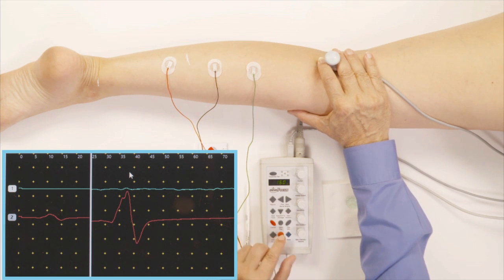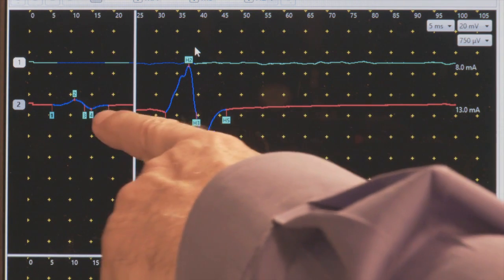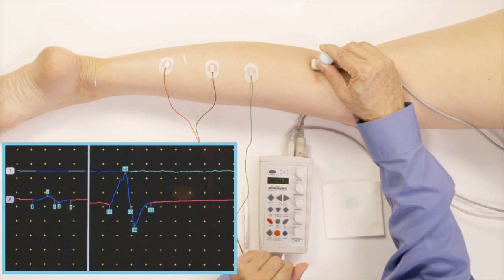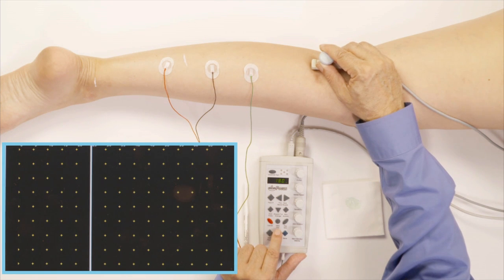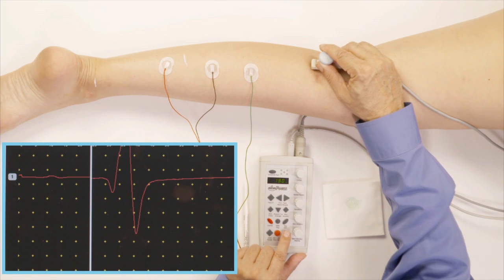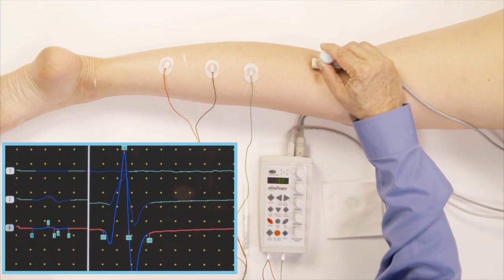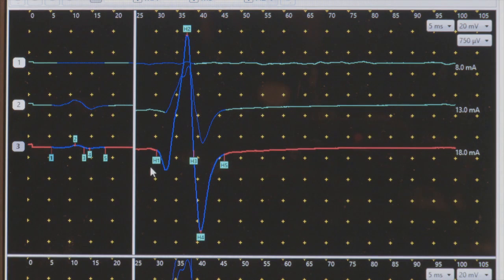Here we go, and I'm gonna store that. So that's the H reflex and that's the motor nerve before it. And that's a great H reflex. I'm gonna give it another stimulation right here, and also that's a great H reflex. So I'm gonna store it right there, and those are great H reflexes. You'll notice that the computer placed the cursors in the right place.